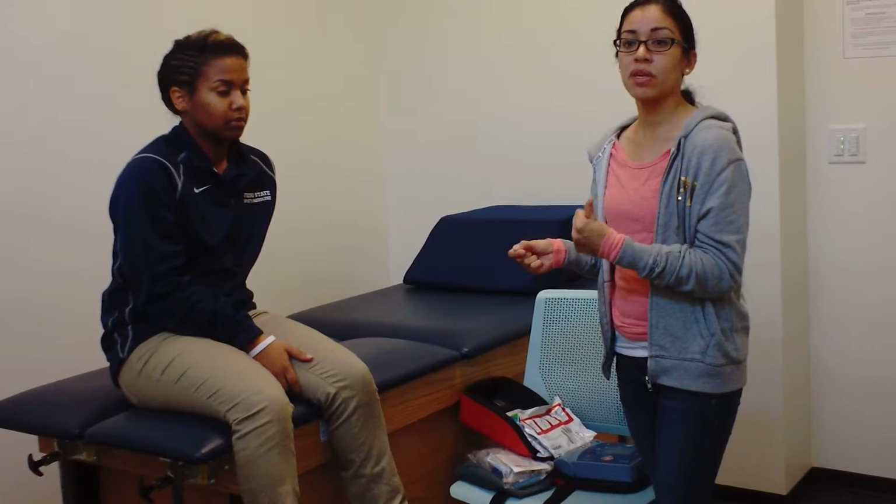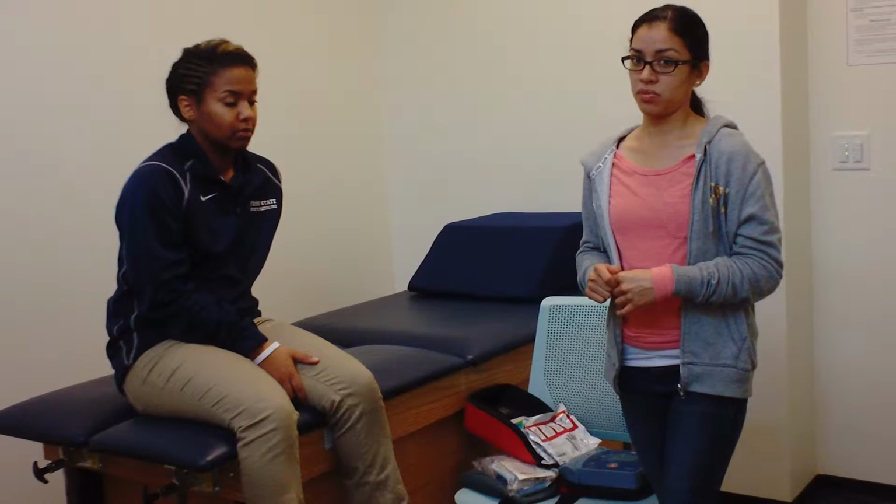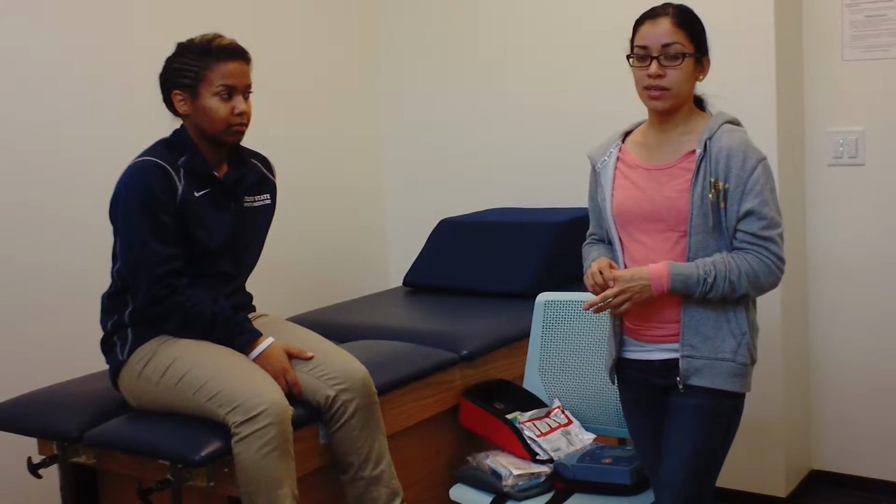Now this is where I need to ask myself, did I witness this person have a sudden cardiac arrest or did I not witness the person? If I did not see the person have a sudden cardiac arrest, I'm going to start with CPR. I'm going to ask somebody to call 911 and bring an AED with me. If I saw the person go down with sudden cardiac arrest, I'm going to want to use an AED as soon as possible. So we're going to say that I did not witness Hallie have a sudden cardiac arrest.